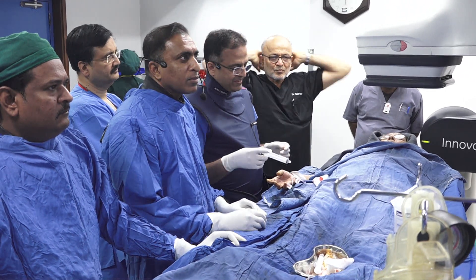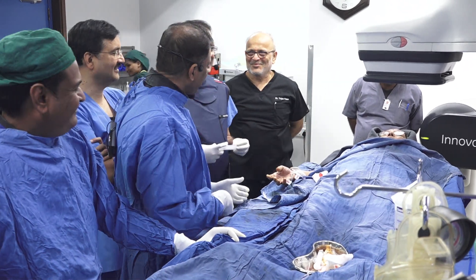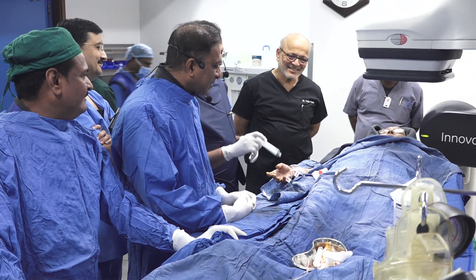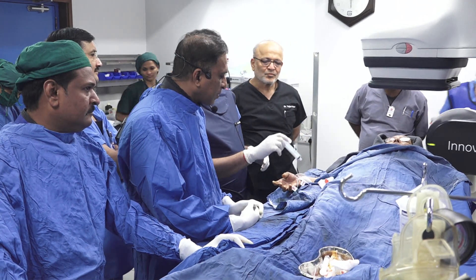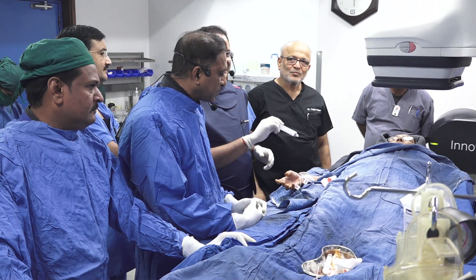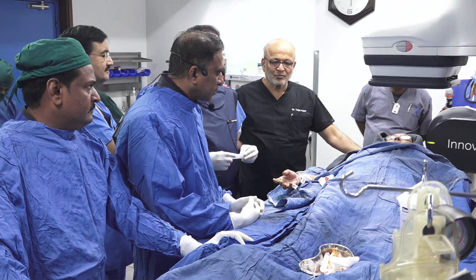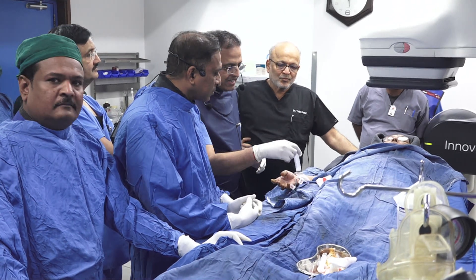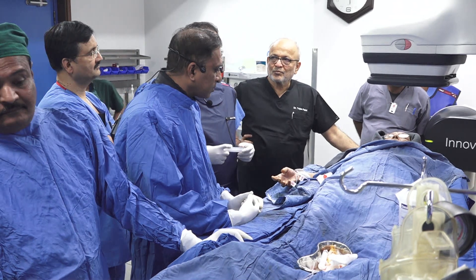If you don't believe in ulnar compression, you can use it as a radial band — you don't have to worry about the ulnar balloon. But I can prove that the ulnar balloon does more work. It is the balloon pump of the radial artery; it will keep the radial artery open. And if you have ulnar access, you can absolutely use this as a primary ulnar band, because we always access the ulnar very distally, so the balloon is right there where it needs to be compressed.